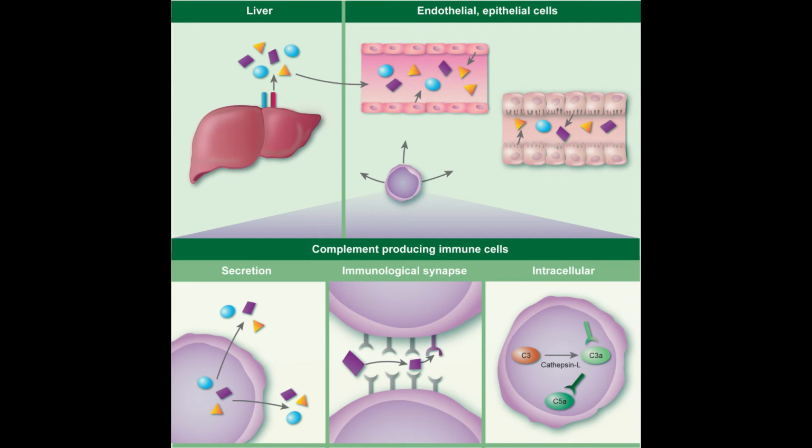The cell control is a check on spontaneous lysis. Lysis should be absent or extremely low. The complement control tube should show lysis to indicate that the complement is working correctly. Due to the amount of manipulation required and the need for standardization and numerous controls, the use of complement fixation in the clinical laboratory is limited.